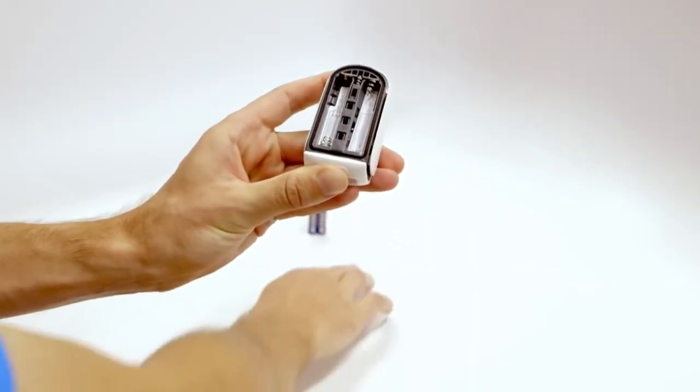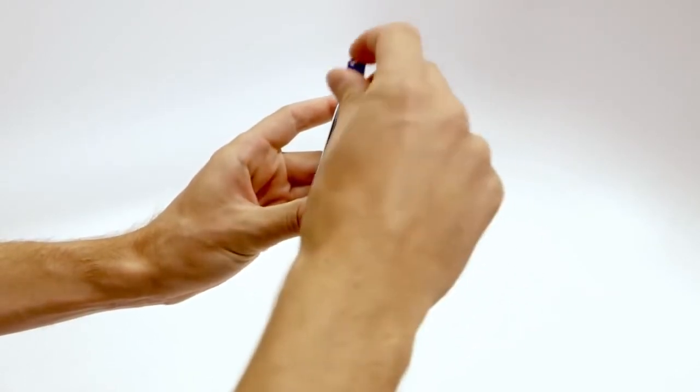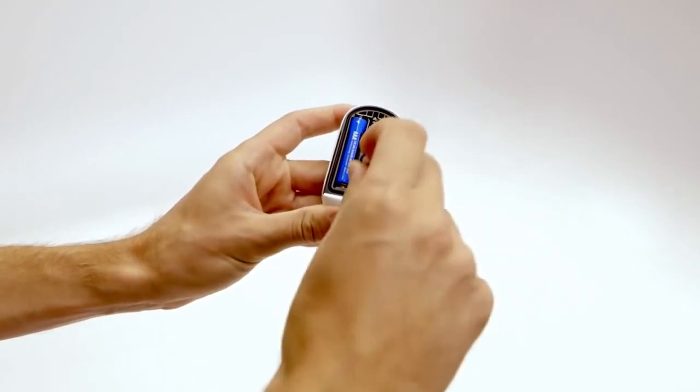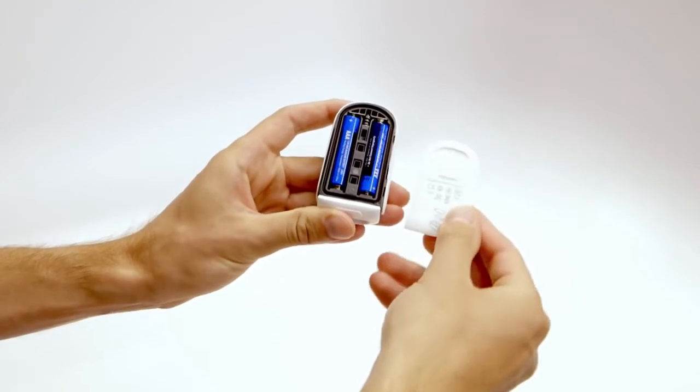Insert two new AAA alkaline batteries, carefully matching the orientation labels — plus and minus. Once the batteries are correctly inserted, carefully snap the battery door back onto the device.